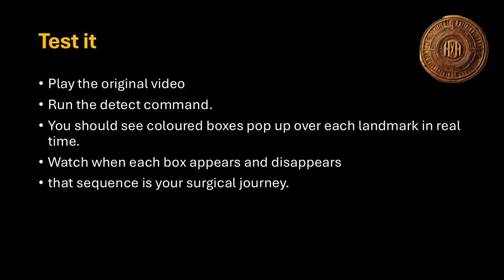After training, how do I test it? Play the original video and run the detect command. You should see colored boxes pop up over each landmark in real time. Watch when each box appears and disappears. That sequence is your surgical journey.